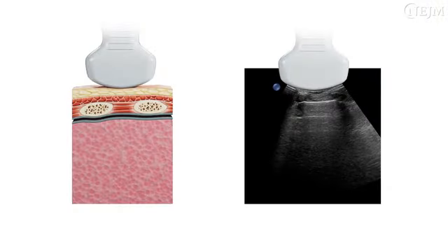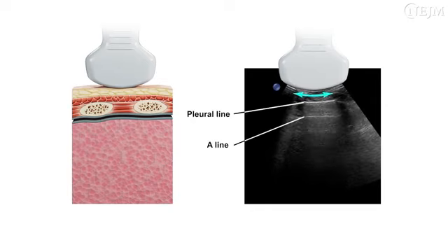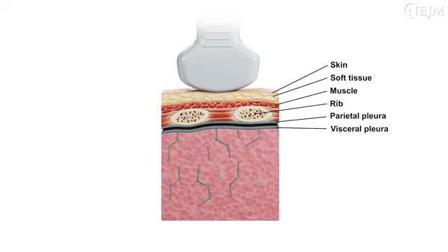At the initial stages of many lung diseases, an ultrasound image may be normal, similar to lung ultrasound seen in fully aerated lungs, including visible lung sliding, a smooth and echoic pleural line, and visible A lines. When lung aeration is reduced, the subpleural structures along the course of the ultrasound wave become more accessible and produce a variety of abnormal findings.